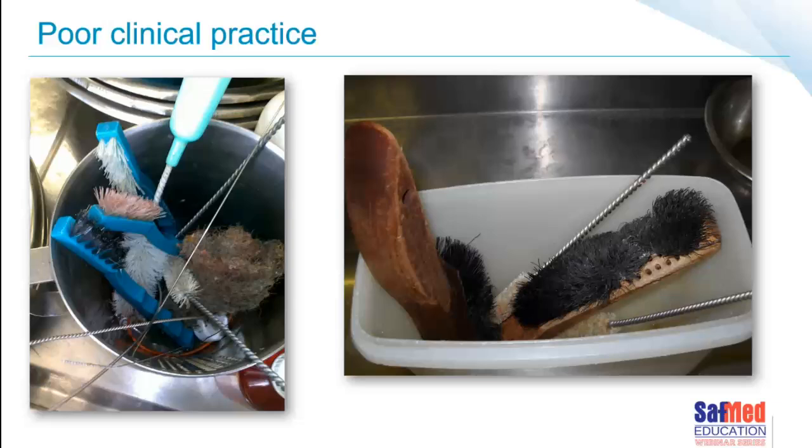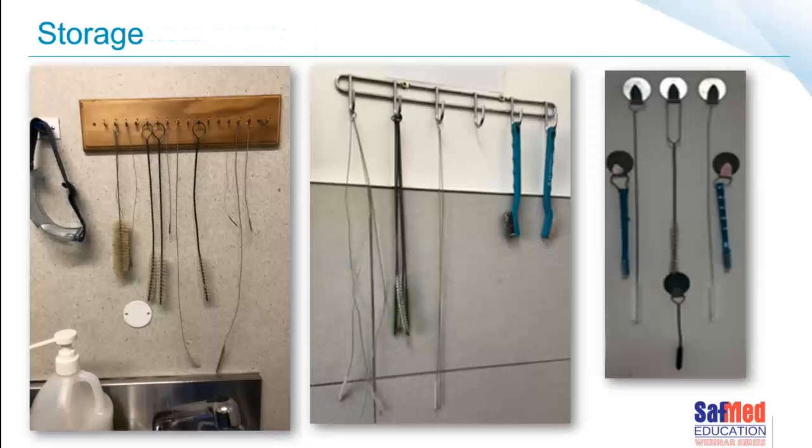It's really not the way to be cleaning, and we really should not be using steel wool. In my mind, that steel wool, certainly on the day that I saw it with my own eyes, was in fact starting to corrode a little bit. You can only imagine how much damage a piece of steel wool will cause. Remember, you do not want to destroy the passivation layer on the instrument. If you destroy the passivation layer, you open it up to corrosion. You're also creating a fine little groove, and in that fine little groove is a place for a microorganism to hide. Brushes need to be stored in a manner that they are kept dry and that they are not going to be recontaminated.